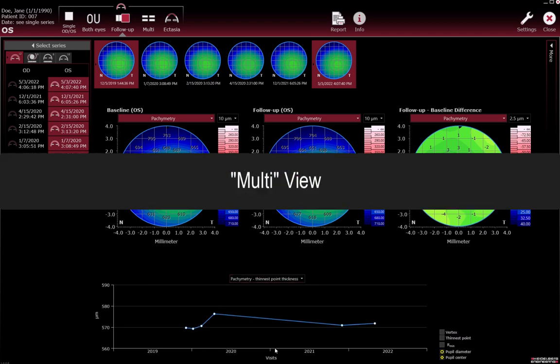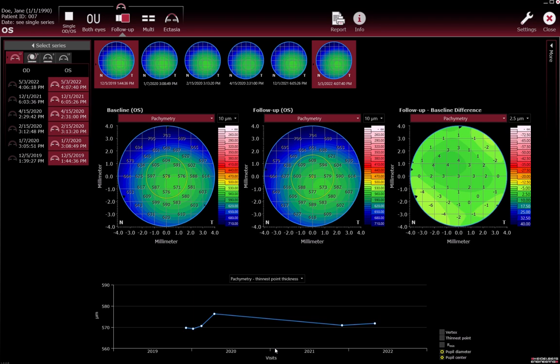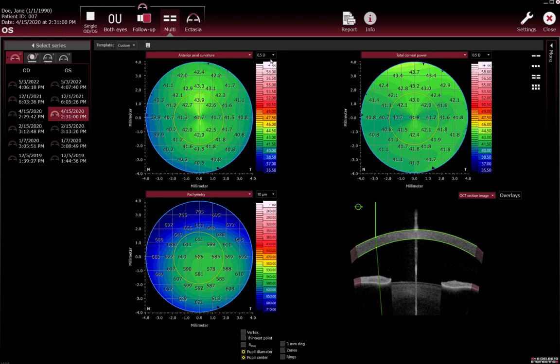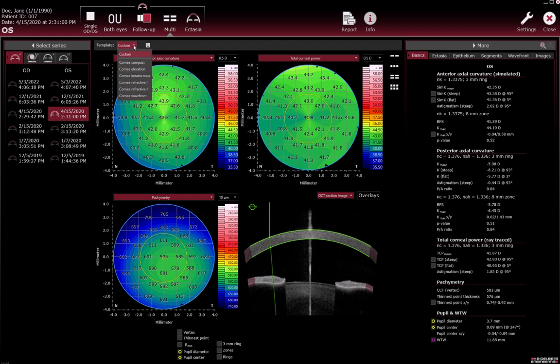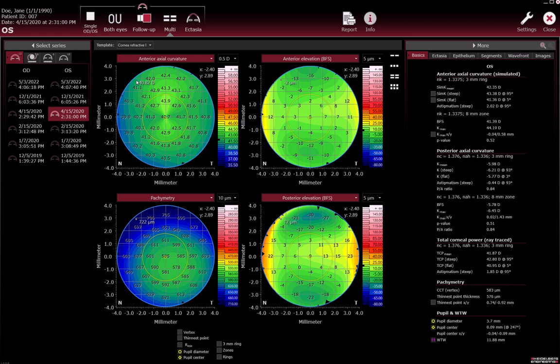Multi view. If you want to see different colour maps at the same time, click the Multi button in the menu bar to open the Multi view. Either the standard templates or custom templates can be used to analyse the data. By default, six templates are available on every workstation — for example, Cornea Refractive 1 — to view different corneal maps of the same eye at the same time.